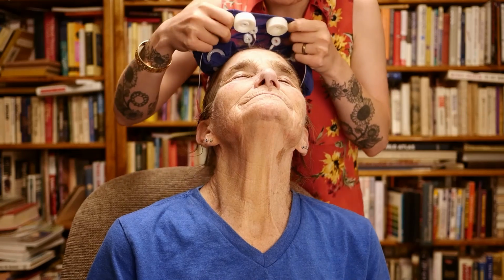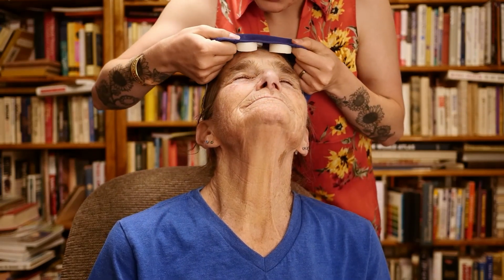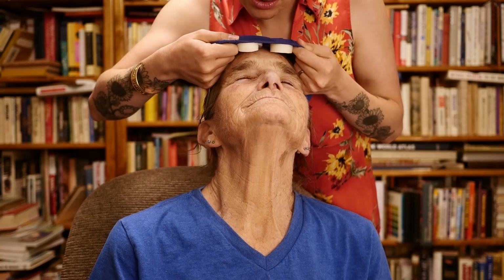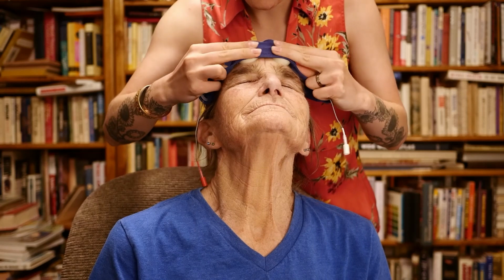So, now I'm a short person, so my trick is usually this. I'm going to ask the client to go ahead and look up at me because I'm going to stand behind them. Perfect. And now what we're going to do is we're going to position these right over the eyebrow and just past the center of the area.